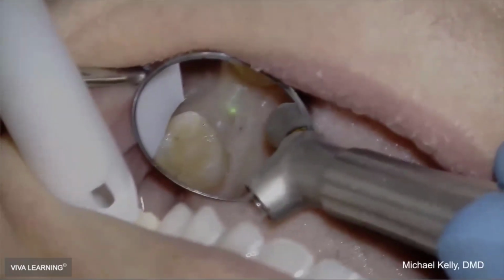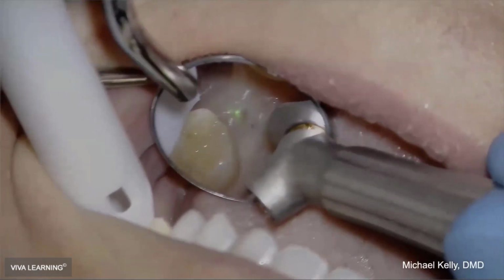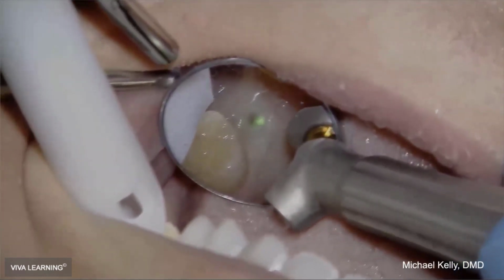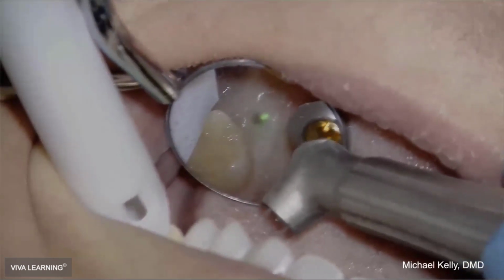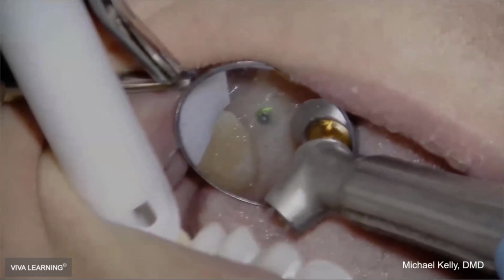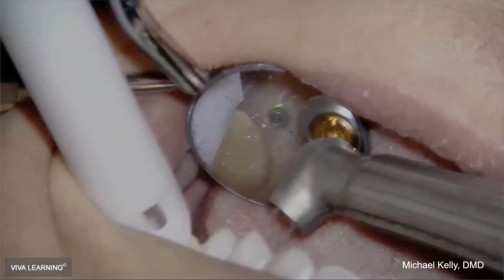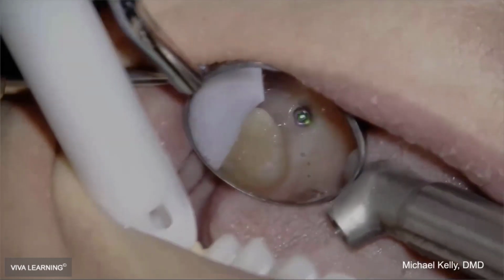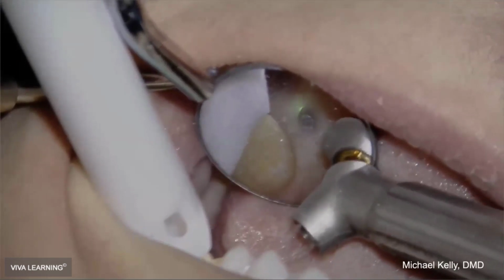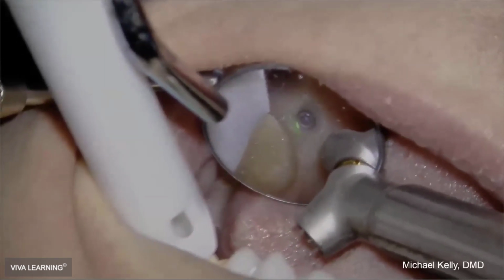So we're going to show a video uncovering an implant. This is more of like a freehand approach, if you will. We're obviously assuming the implant is in the middle of the two teeth, which is not always the case. And the key to these types of procedures is really you're just easing onto the foot pedal at 20% power. Really just trying to let the tissue talk to you. Is it removing a little bit too fast for your comfort level? Do you feel like you can control the contours of the emergence profile? If you feel like it's a little bit jagged, you're normally cutting too fast or your hand is moving too fast.